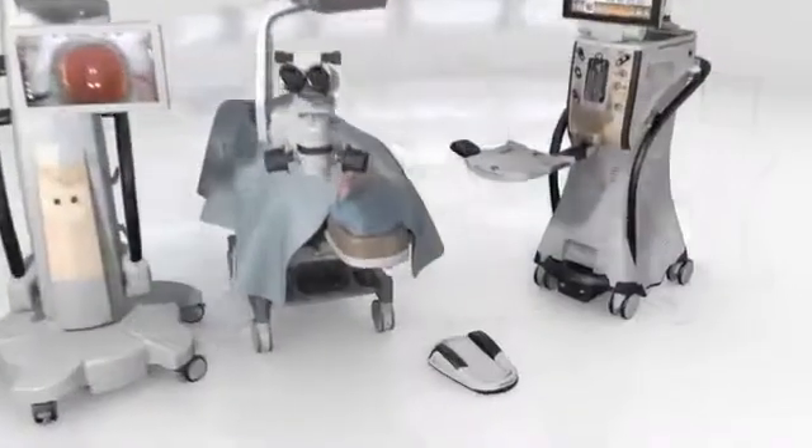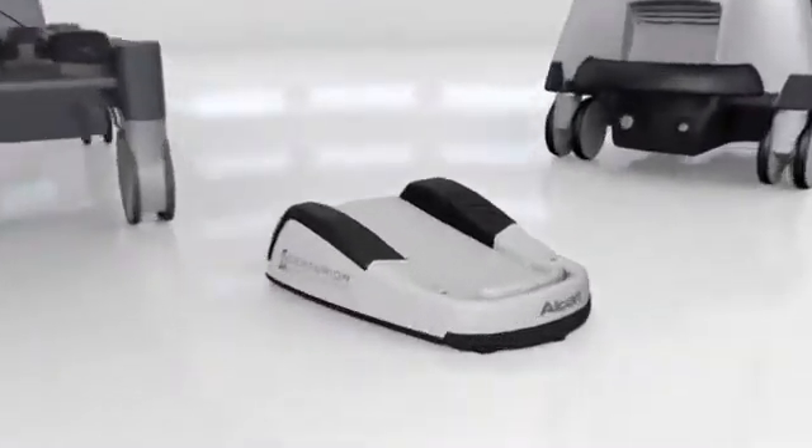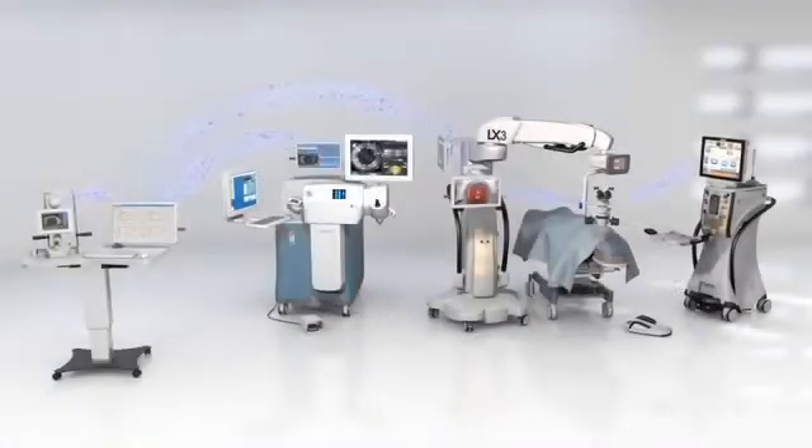All of these procedural steps can be wirelessly controlled by the Centurion Vision System foot pedal. See what the Verion Image Guided System can do for you — it might just change the way you perform cataract surgery.